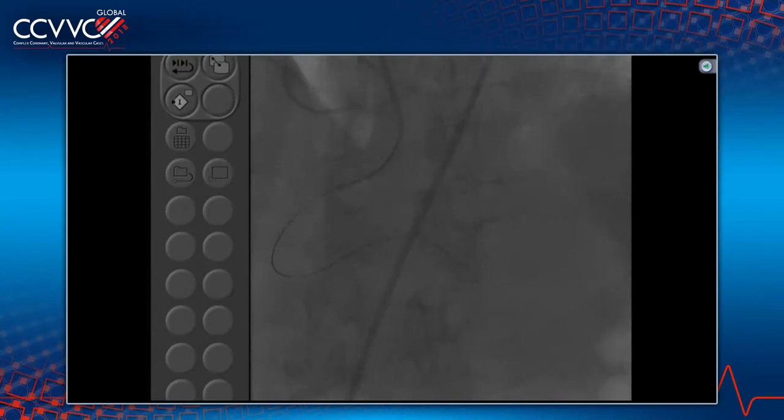A little resistance there. But yeah. Get us the 300 RunThrough ready. Yeah, ready. You have it? Yeah, I think it advances a little bit. I can't see from the lights. Yeah, I can. We can see that. It may be at the crux, we may have some difficulty.